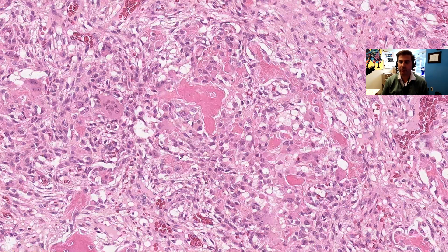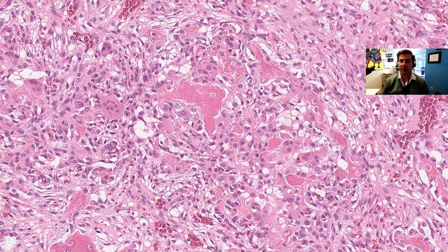In a higher power view, we can see that this bone is composed of a haphazard distribution of woven bone with osteoblastic rimming. You can see the osteoblasts rimming this bone, and the background stroma is very richly vascularized — see all these blood vessels here. There are scattered osteoclasts in the background. So we have this relatively indolent radiographic picture of a predominantly lytic process with a central bony nidus with a benign appearance.